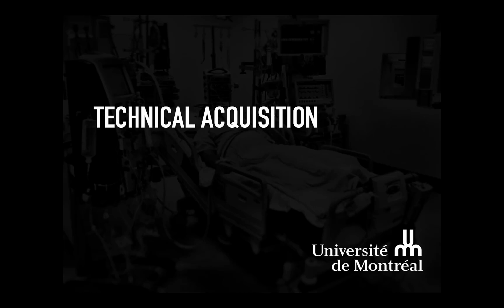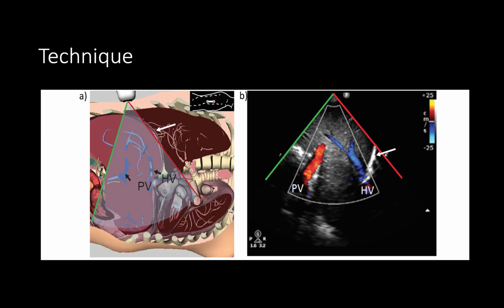Next, we will discuss the technical acquisition that forms the basis of portal vein Doppler assessment. The transducer is positioned on the anterior to mid-axillary line to obtain a coronal view of the liver. Generally, this provides a good alignment for pulse wave Doppler. The hepatic vein can usually be sampled from the same location. One important technical consideration is ensuring that there is a recorded ECG tracing on the machine. While less problematic than with hepatic vein Doppler, the ECG ensures the proper identification of cardiac phases.